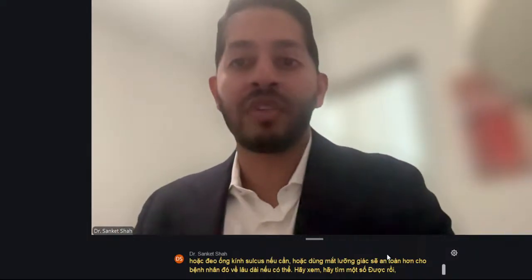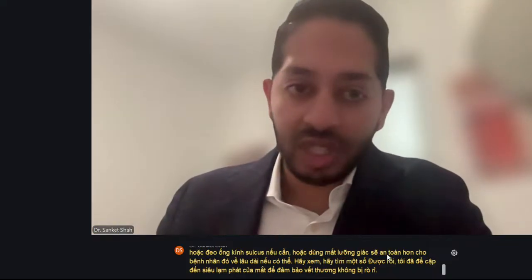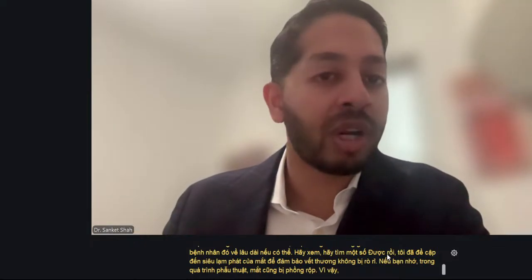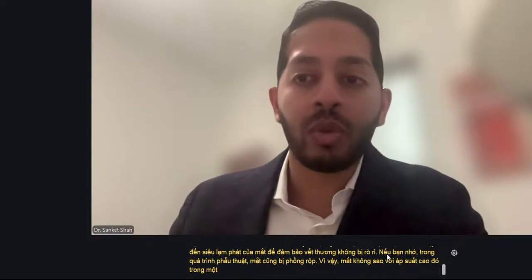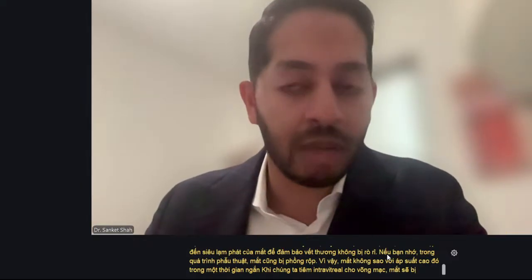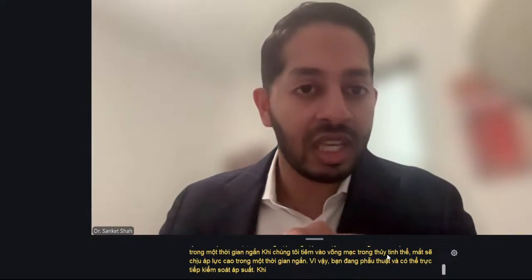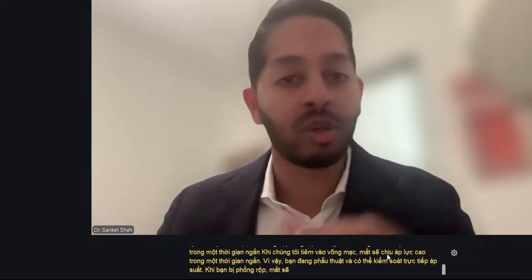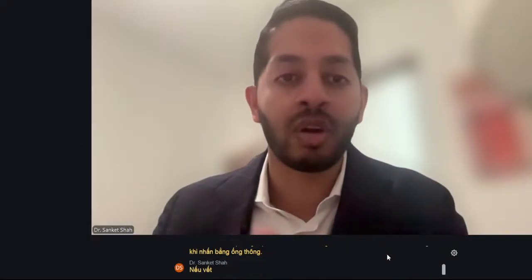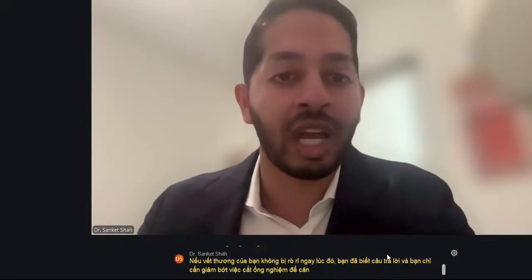I did mention hyperinflation of the eye to ensure no wound leak. If you remember, during surgery, the eye is also hyperinflated. So the eye is okay with that high pressure for a small amount of time. When we do intravitreal injections for retina, the eye goes to a high pressure for a small amount of time. So you are intra-op and you can directly control the pressure. When you're hyperinflating, the eye is going to be hard. You'll feel it. When you push with your cannula, there'll be resistance back. If your wound is not leaking right then, you already know your answer and you can just depress your paracentesis and equilibrate that pressure. That eye might have been at a high pressure for 5 seconds.